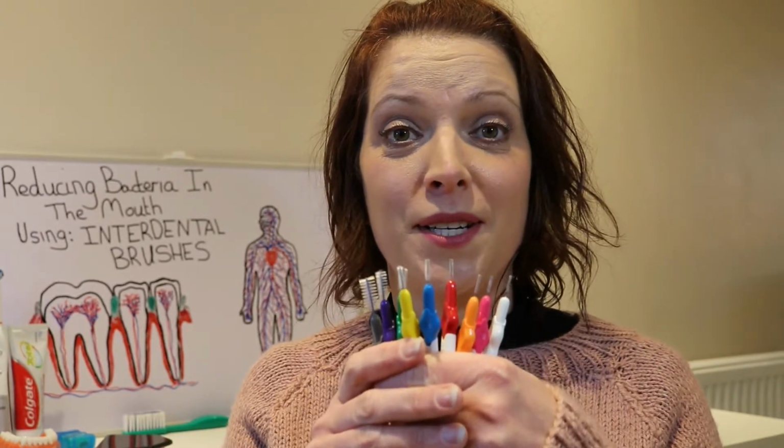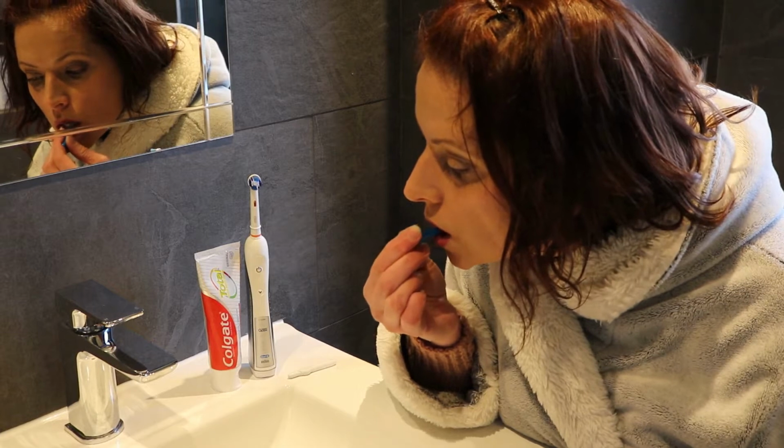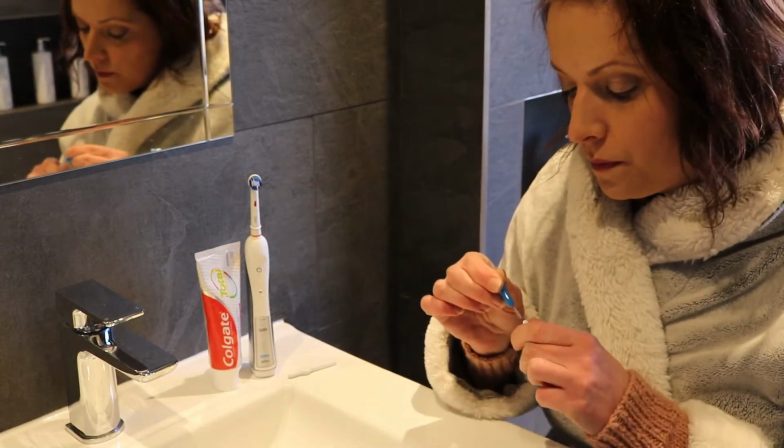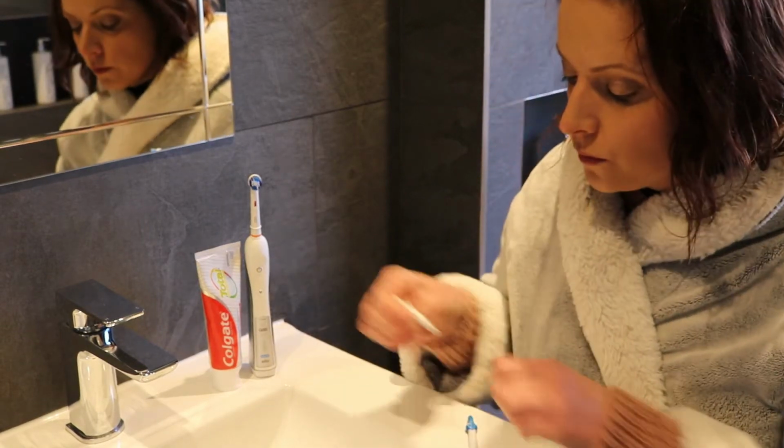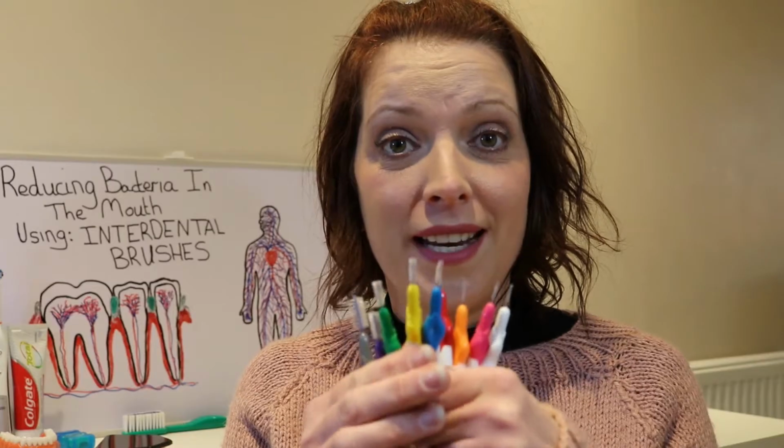So the recommended time to use them is before you brush your teeth at bedtime, so you can get rid of all that nasty bacteria before you go to sleep, and then it's not multiplying during the night. However, this doesn't always fit into everybody's lifestyle. Just fit it in when it suits you.